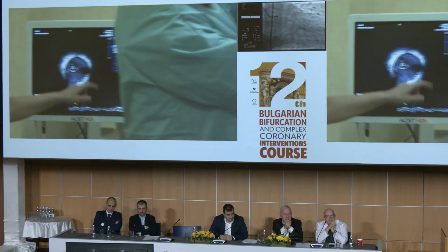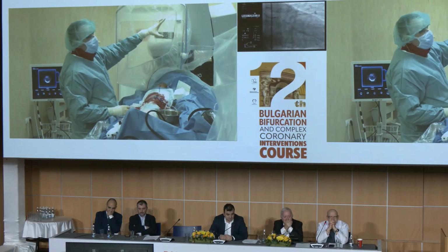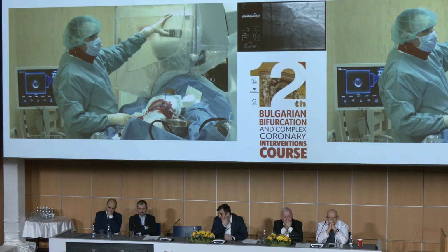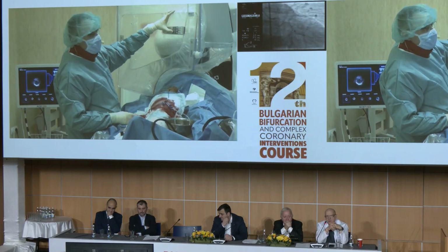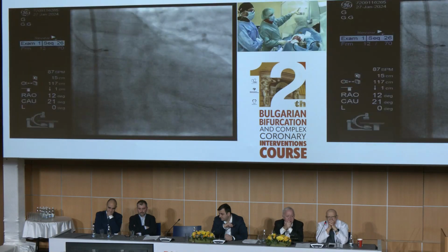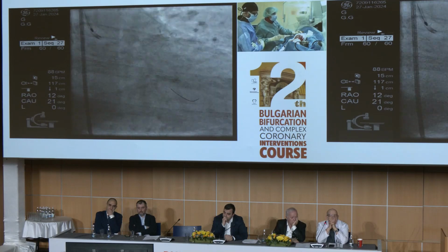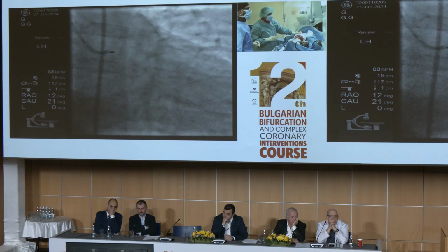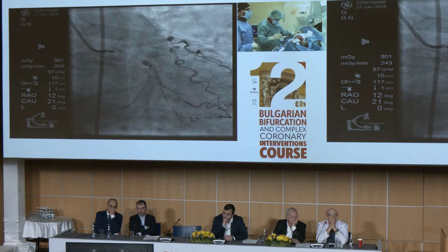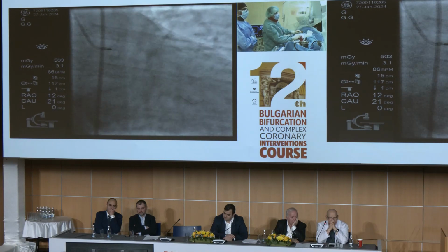Yes. What is the result? We'll see now. The result, this is the rotablation. We made this 1.5. Yes, this is 1.5. Full screen? Yeah, and this is the result. Maybe we should make a better picture, just for the audience. Okay, so this is the result for the circumflex.